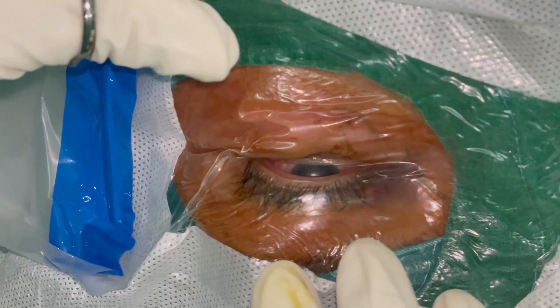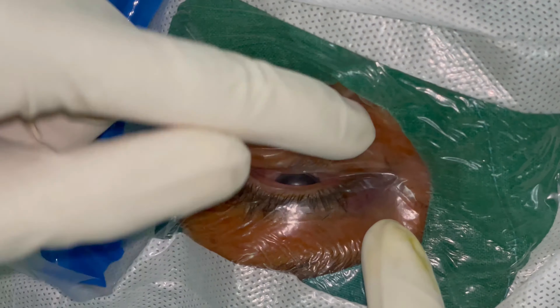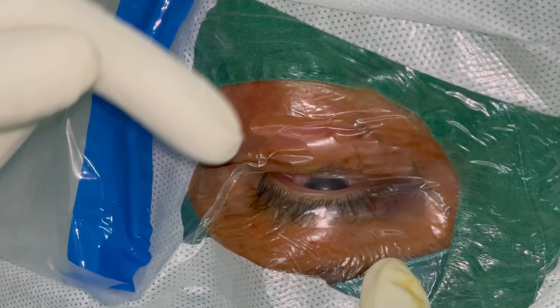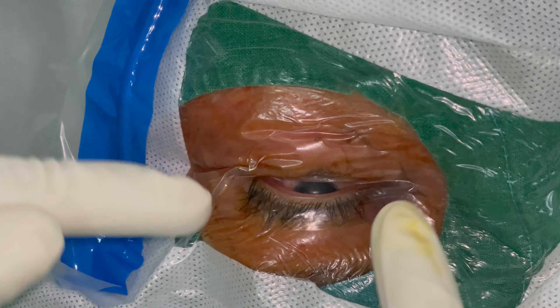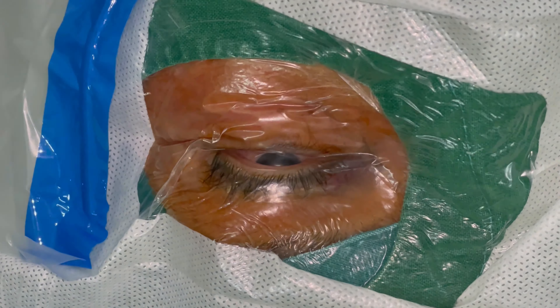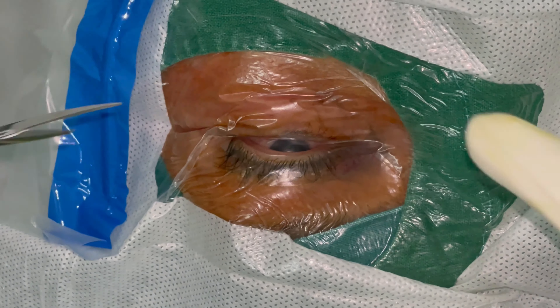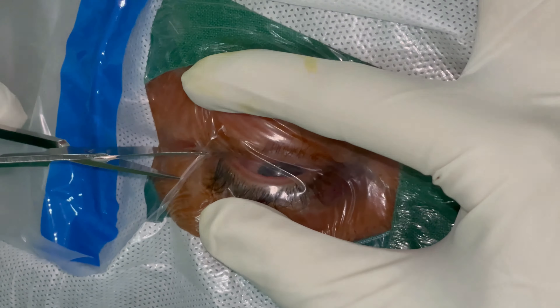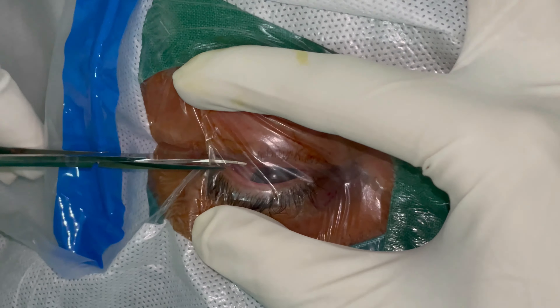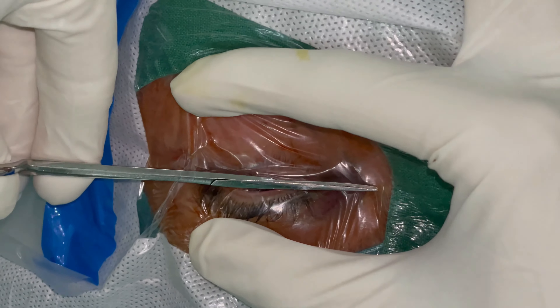A well-adhered drape would actually appear like this — there are no pockets of any area where the drape is not perfectly stuck onto the patient's skin. This clearly and completely segregates the patient's eye from the rest of the face. We then proceed with opening up the drape by cutting it down its middle all the way in the exposed part of the eye.